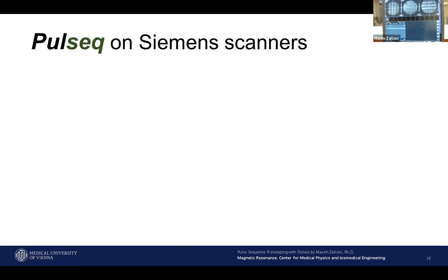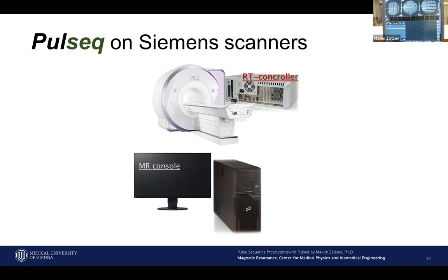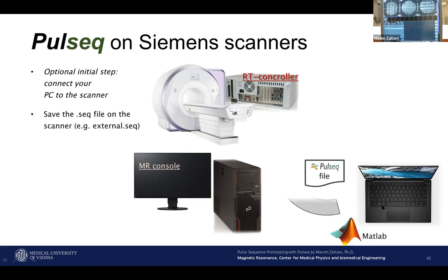So now how you implement it on the scanner, and what you'll see today in the demo: basically we have a scanner, and the scanner has some real-time controller behind the cabinets. We have a console, of course, which you see on the camera, I guess, still. And next to the console, that's me sitting with this little laptop. I have MATLAB running on the laptop. I'll be producing the Pulseq file, and we will transfer it to the console and the real-time controller via the internal network link.